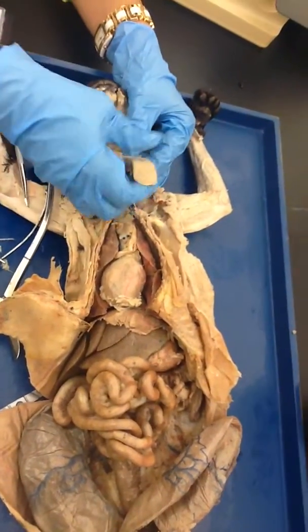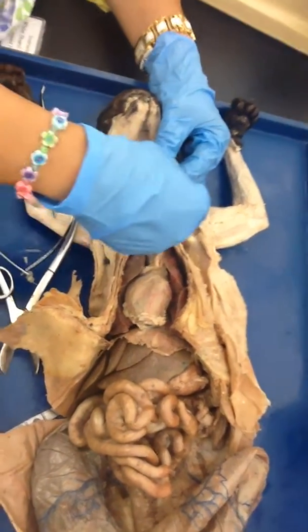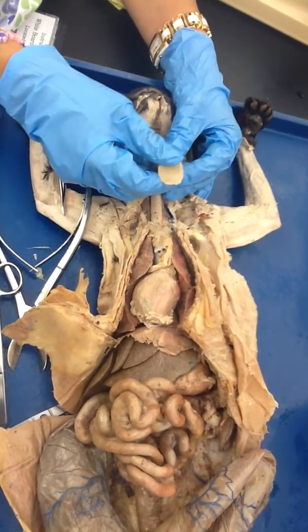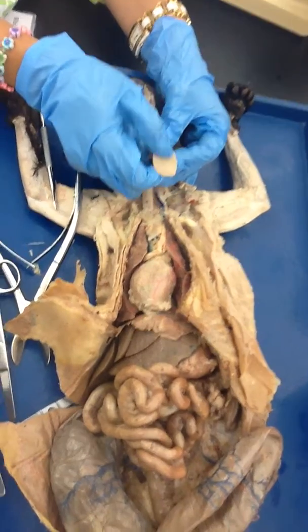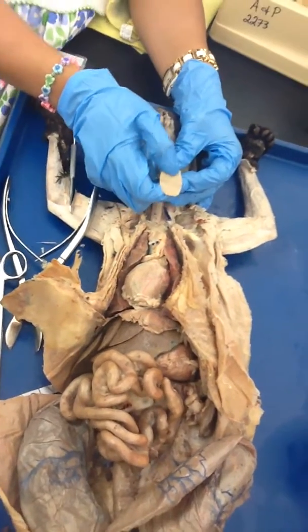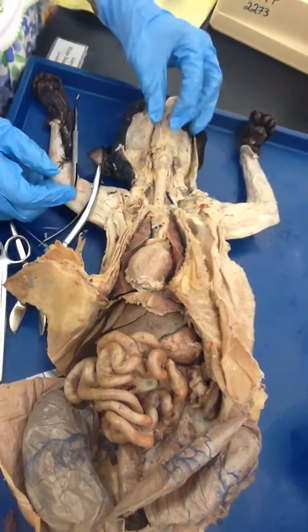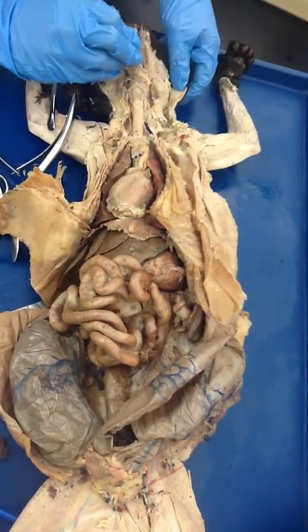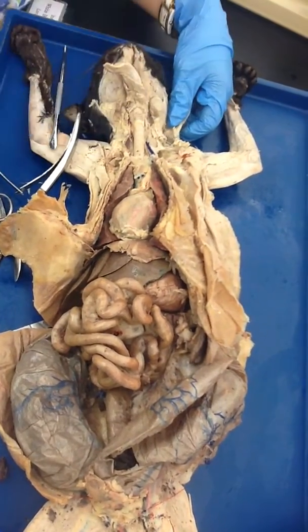This is the tongue. On the tongue, do you see these? These are the filiform papillae. This is what the cat uses to comb its fur — it's like the bristles of a brush. Now we are going to look at the glands.